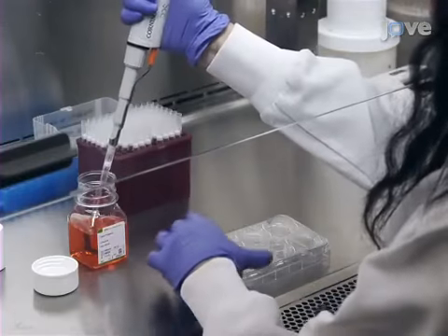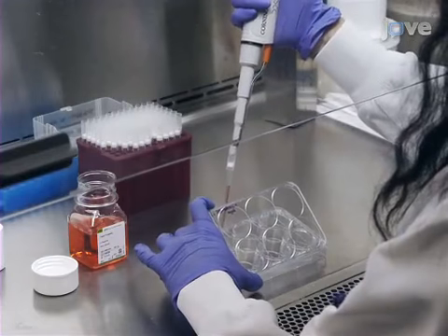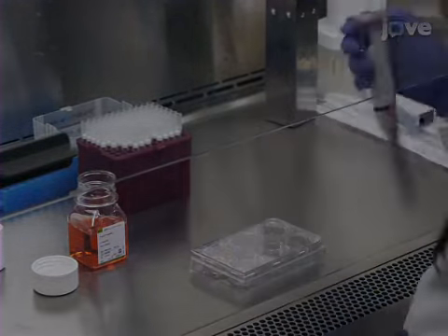First, dissociate a well of cells into a single-cell suspension by adding 1 milliliter of TrypLE.